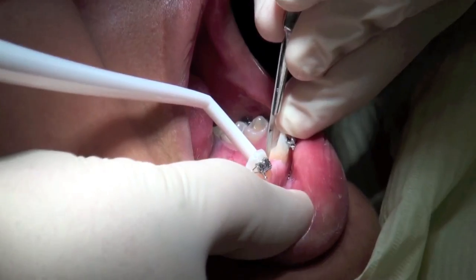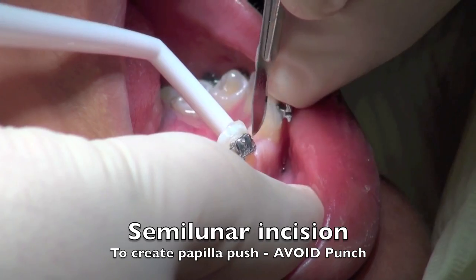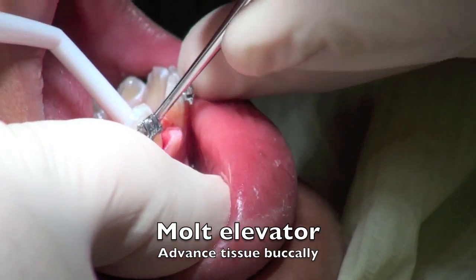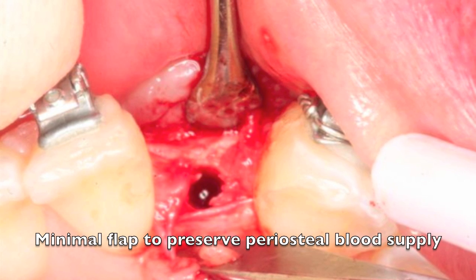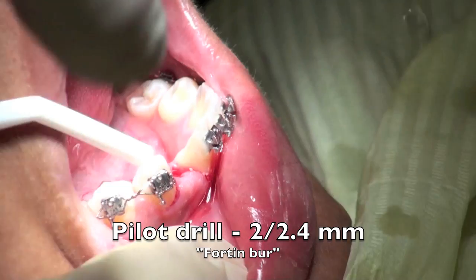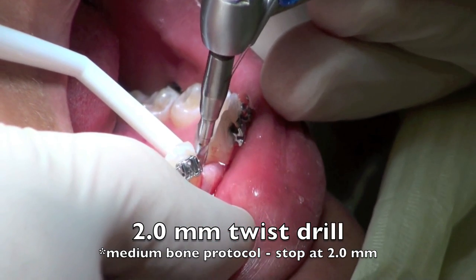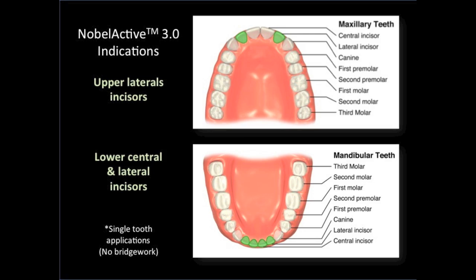We're going to rotate this slightly distally. I like to make some papilla by doing a semi-lunar incision through that initial access hole, but we really do not want to use a punch technique in this area. We want to preserve the papilla as much as possible and bring this tissue forward so we can later lift it up with suturing techniques. Since we had a look with the CT scan we don't have to pull this tissue all the way back, which helps preserve blood supply. We're using a pilot drill first just to follow that initial drill. This bone is of medium quality so we're going to use the 2 millimeter twist drill to length and not go to the 2.4 to 2.8 millimeter twist drill — this is based on the assessment of the bone at the time of surgery by the surgeon.